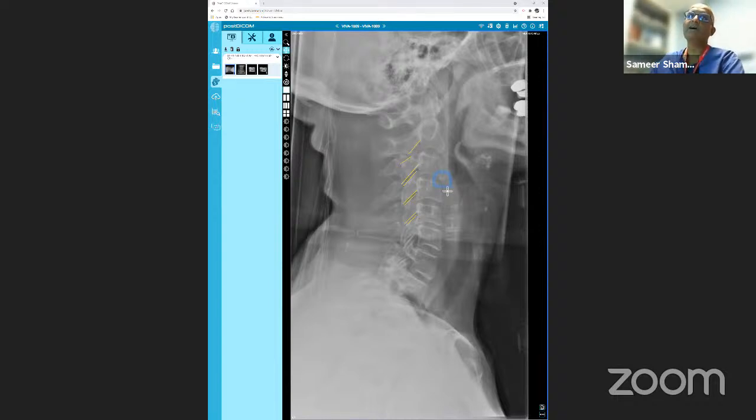Is this unilateral or bilateral facet joint fracture? I mean, unilateral or bilateral dislocation? I think it's unilateral. Unilateral, good. Because the degree of step is very minimal. So if I draw a line here and a line here, you can see the gap is very, very minimal, right? If this was a bilateral facet joint dislocation, the gap would have been more than 50% of the anteroposterior dimension of the vertebral body. So that's when you call it bilateral. Bilateral is very easy to pick up, and most people will see that one. So this is a unilateral facet joint dislocation related to flexion teardrop fracture.